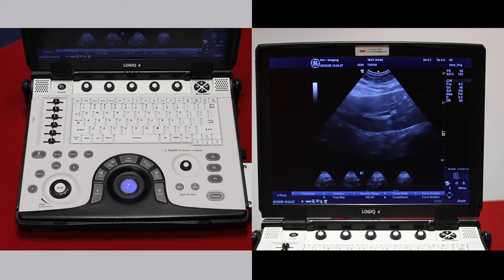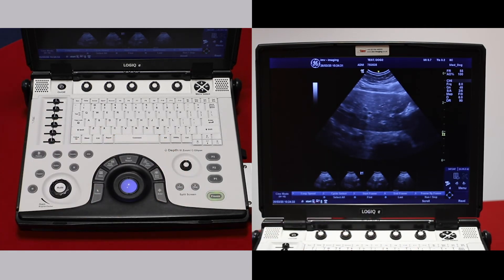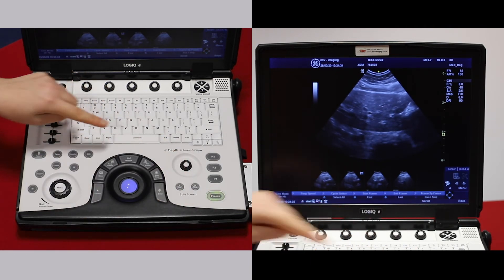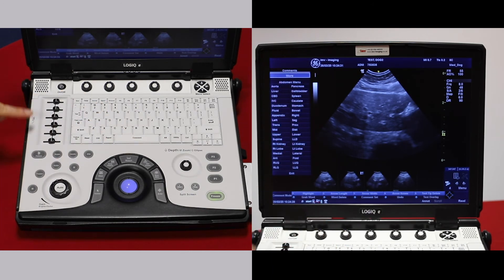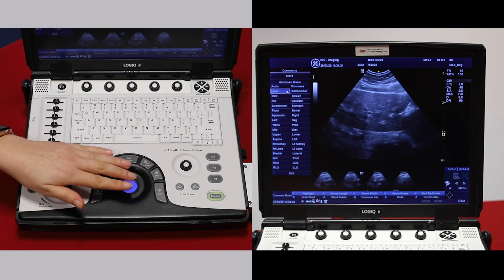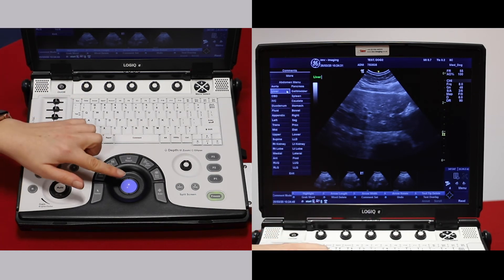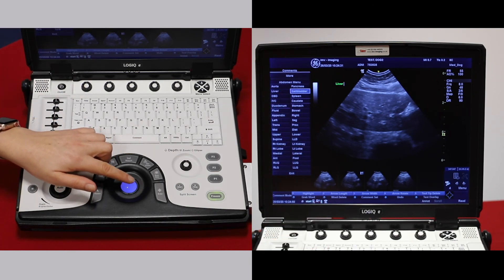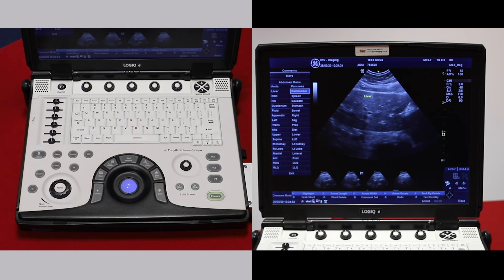If you would like to add a comment, it is done in a very similar way — freeze the image. The comment function is the spacebar on the keyboard. Press this to bring up a list of comments. The comment appears in the top left, and you can then move your trackball to place the comment and press enter to confirm it.